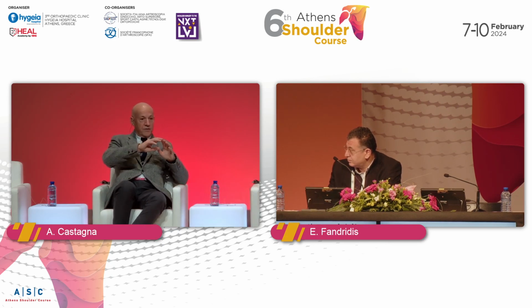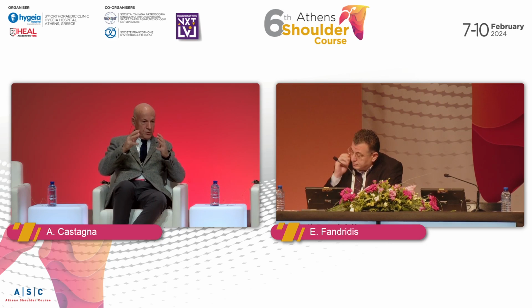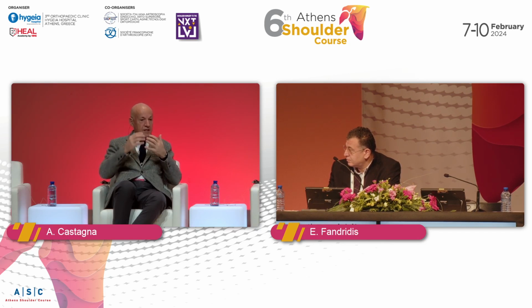So if you ask me about the future, not where we are today, it is this: to develop affordable systems that may lead to a very customized design, at least in the more complex cases. You know my history, you probably listened to this, the green, yellow and red light that I use for my fellows. Tell me if I'm too long, Manos. I have 3 levels. Green light: my fellows do the MPR, they evaluate the glenoid and so on.